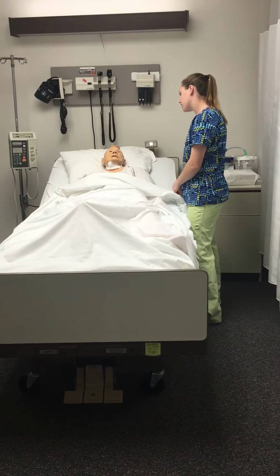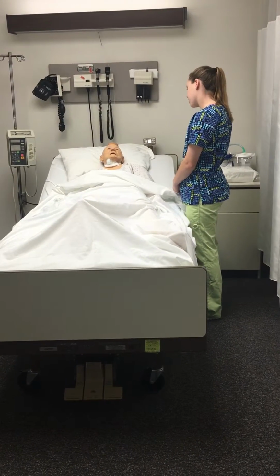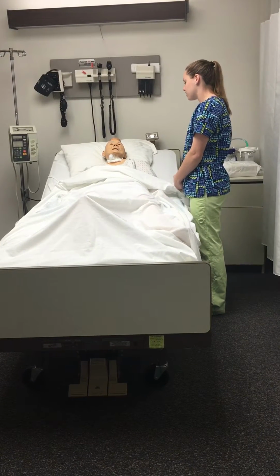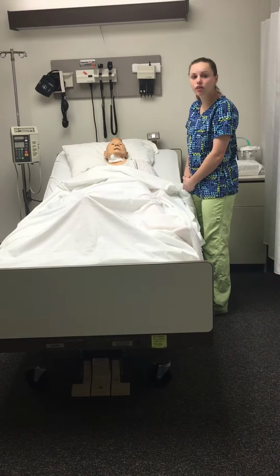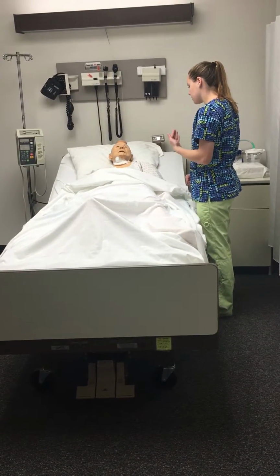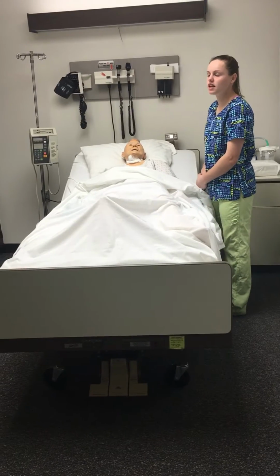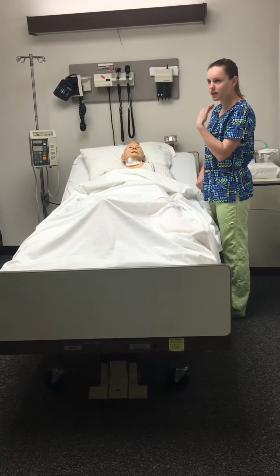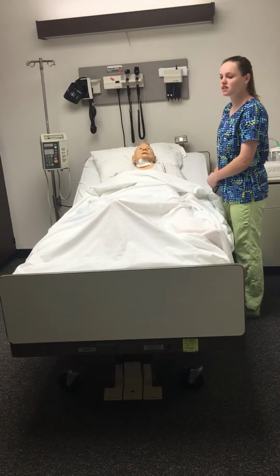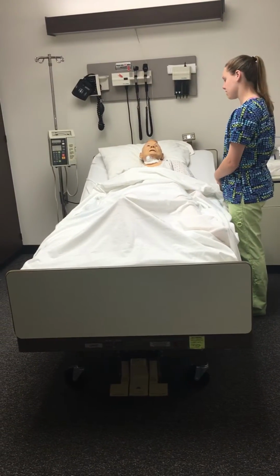So Jerry, today the doctor has asked us to insert a catheter inside of you. Do you have any previous knowledge about catheters? And since he's had one before, he doesn't need any further teaching. So we could proceed with the care. He also just came back from a bath, so his peri area is clean. And for the purpose of this skill, Jerry will be a female.